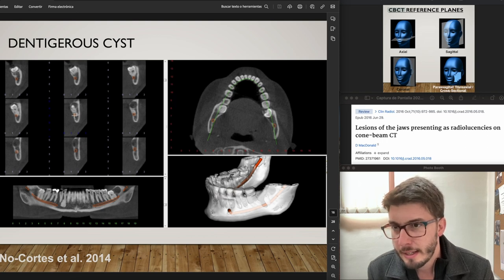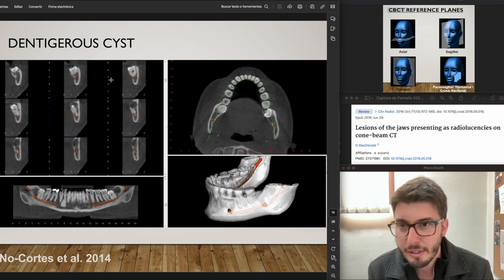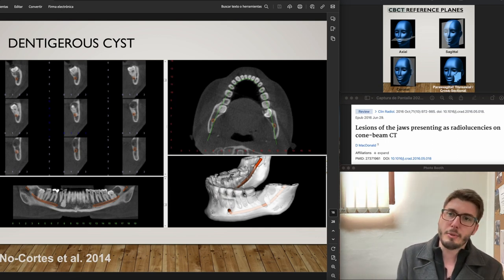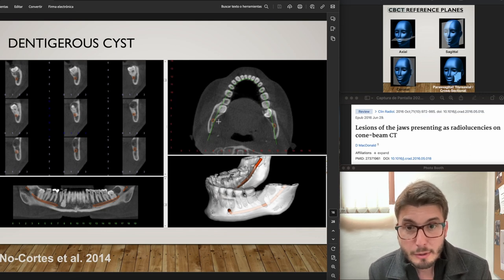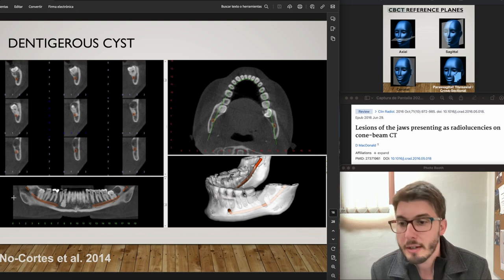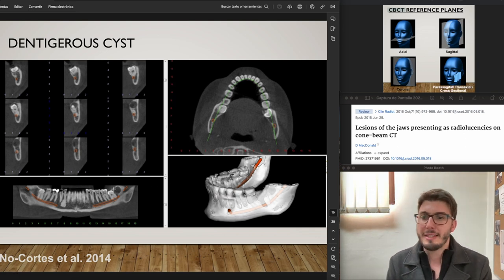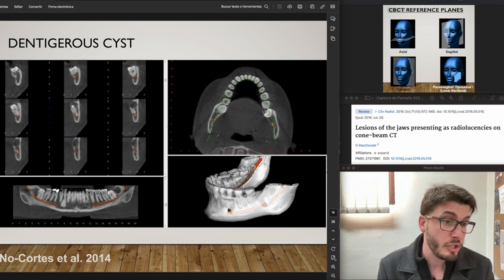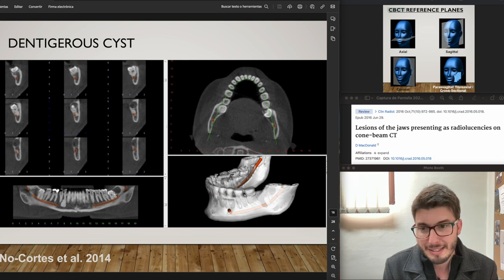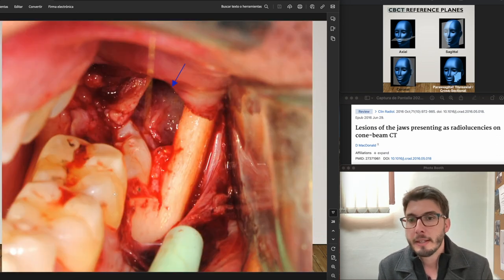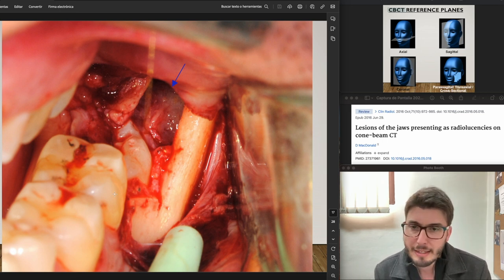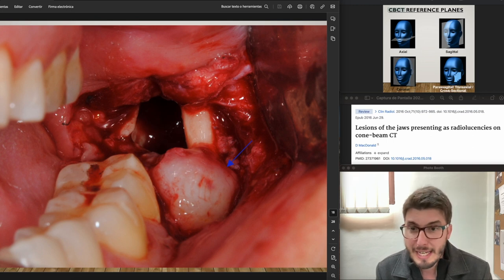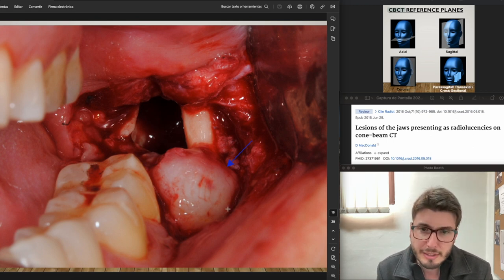We have the mapping of the mandibular canal, where the inferior alveolar nerve runs — that's what we see in CBCT. The green line shows the axis of the coronal panoramic image. This would be the lateral pattern of a dentigerous cyst — the first diagnosis — it's well attached to the CEJ, as dentigerous cysts usually happen, mostly associated with impacted lower third molars and upper canines. The cyst was enucleated — here it is out of the cavity, the epithelial tissue surrounding the cyst.